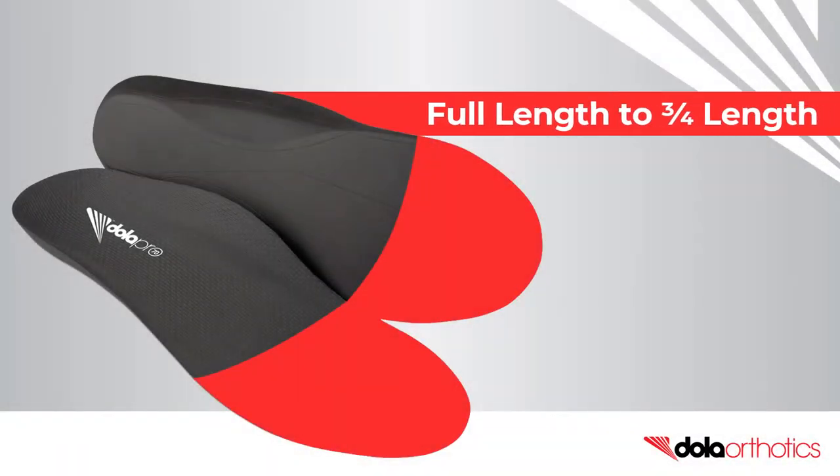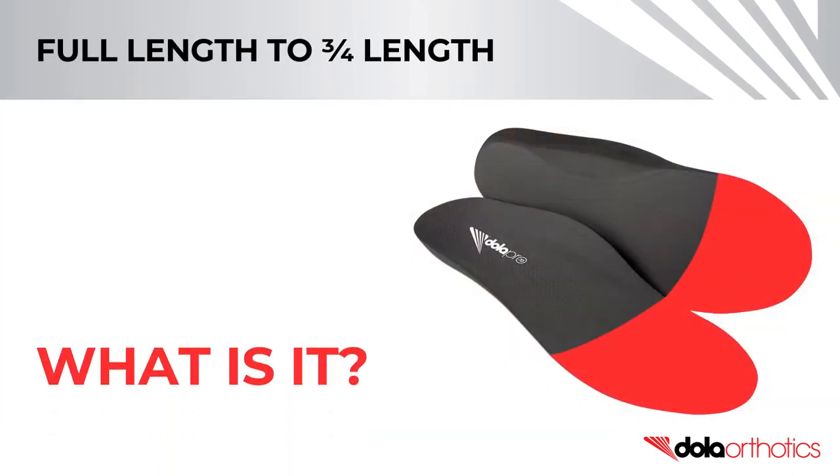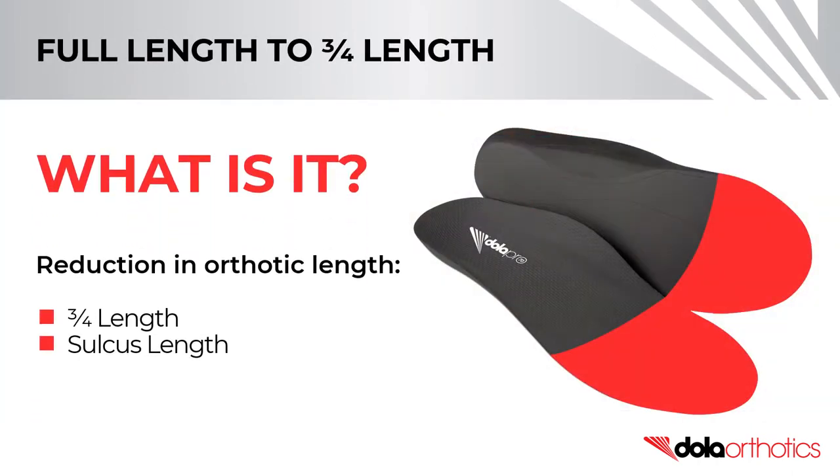How to modify a full-length Dola Pro orthotic to a three-quarter length shell. This modification is the reduction in the length of the full-length Dola Pro or ProFit models by the removal of the forefoot extension.